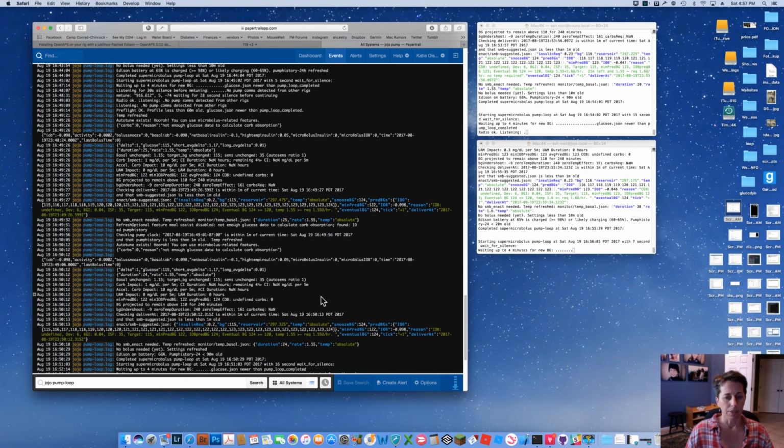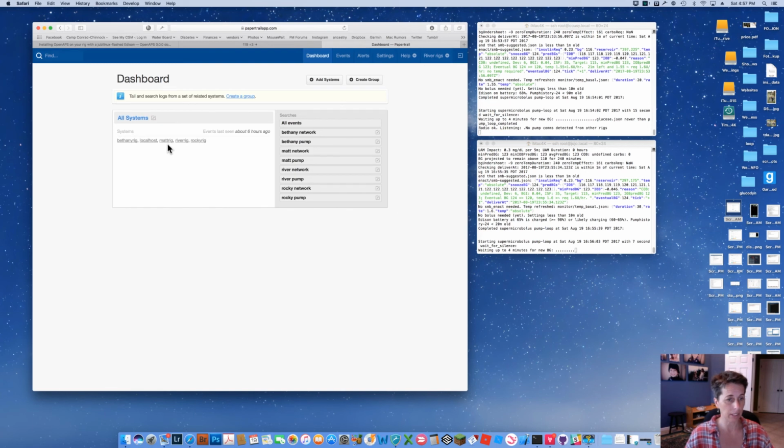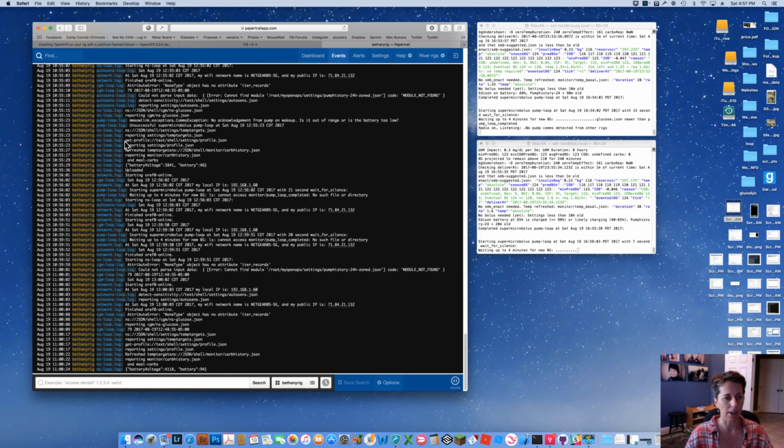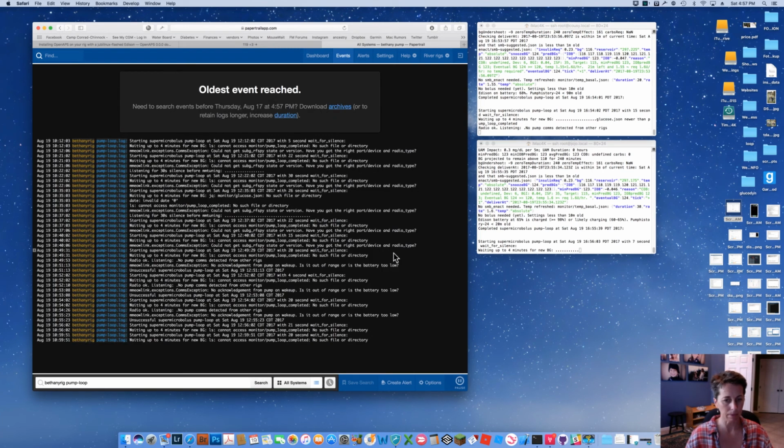So if your rig is failing, what kind of messages will you see? Well, unfortunately, for the purposes of this video, everything's working fine. So I'm going to go to one that recently wasn't working fine. For example, this rig, let me go back and I'm going to do her pump loop for this particular rig. This one has a couple of the most common messages that show up for when your rig isn't working.